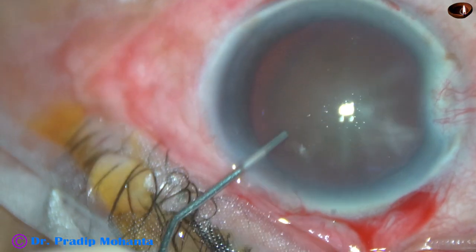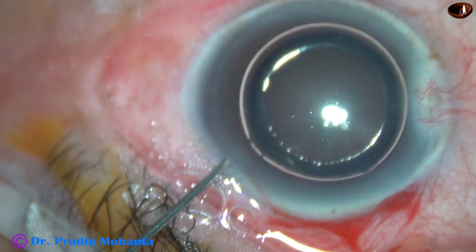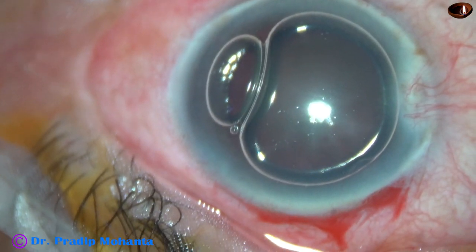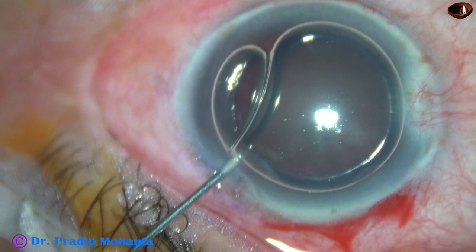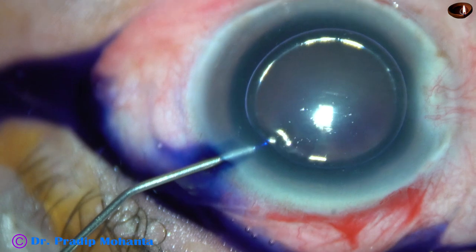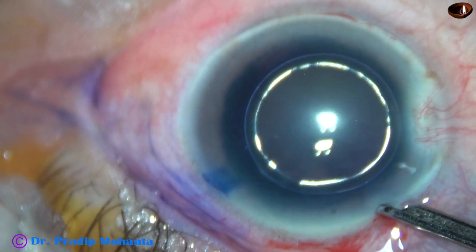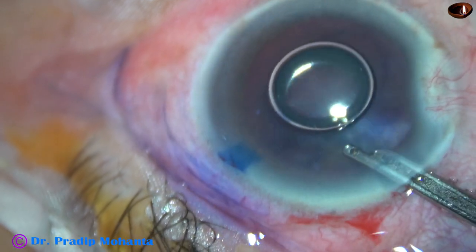Now I inject an air bubble, and underneath this air bubble, trypan blue dye. The trypan blue dye is applied over the anterior capsule. And now the dye is washed out with BSS.